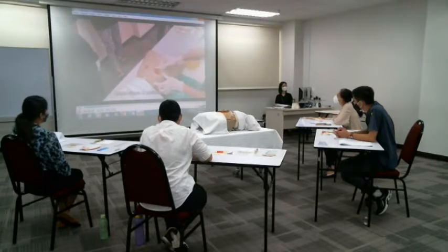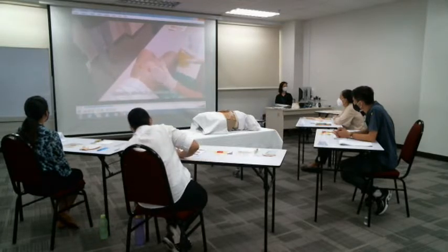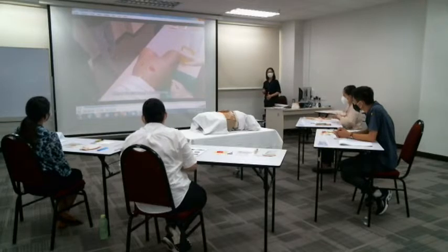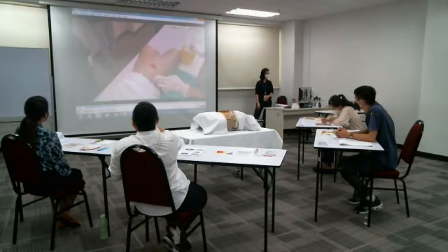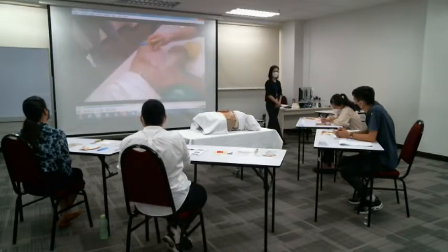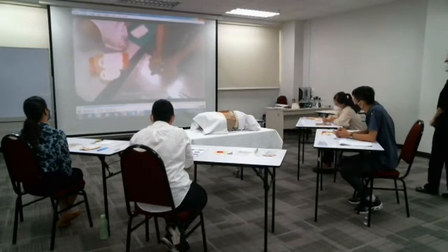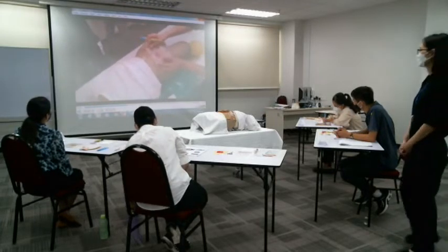Then after this, I will clean the peristomal skin. So use the wet tissue to thoroughly clean and observe it. Look at the stoma, is it healthy, pink, moist, and functioning? Functioning means there will be stool coming out from time to time. Okay? And after that, the cleaning is done. So I will write today's date towards the patient's back.